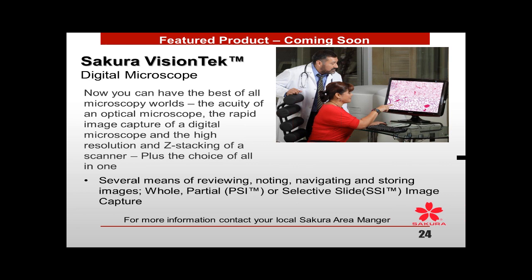Most often, though, the pathologist sometimes will be looking at the initial scans and then may want something else rescanned. That's where a lot of times it loops back to the histology department again. Once they have all the scans they need, they'll annotate them, but they may want new scans, and that's where you'll loop back to histology again. But it really starts with the digital scanning software and how that is connected to your reporting software, how much time and effort the pathologist is going to have to spend.